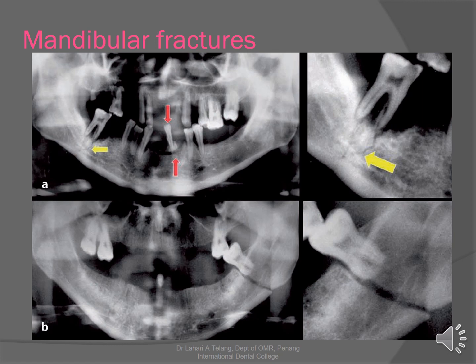This is one particular case which is showing you fracture in multiple areas, 2 cases in fact, A and B, where the fracture line is extending all the way from the crest of the bone to the lower border of the mandible. So fractures where a tooth is involved generally become unfavorable fractures, which means they are difficult to treat, but yet fractures can be treated in the surgery department.